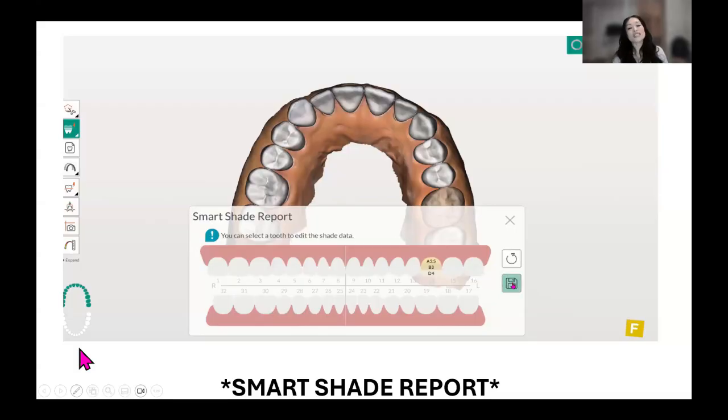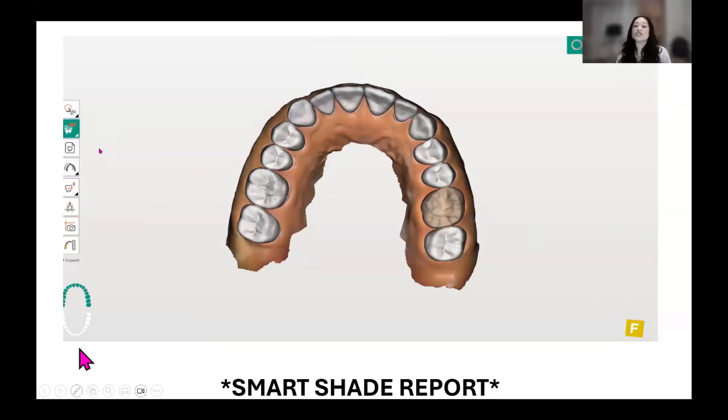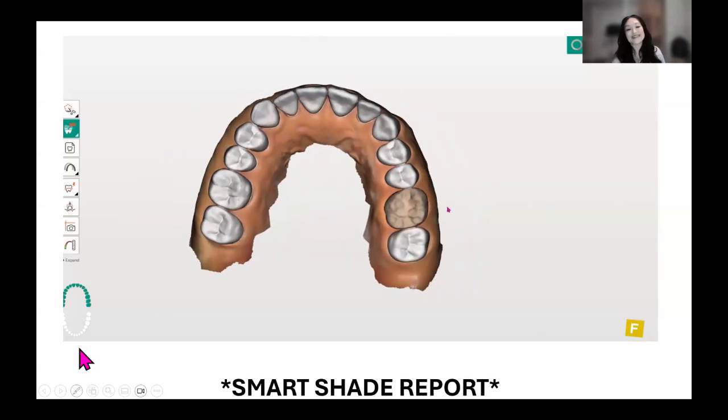And that's so important because that's when we truly can appreciate it. Oh, by the way, we just saved that, so it's going right to the lab. You don't even have to write in the lab script. But here's the manual shade. And watch as we move that cursor around that occlusal table. This is the last crown that I made in the clinic for this model. It was my last crown. It's beat down now, but it was the last crown that I made in the clinic.